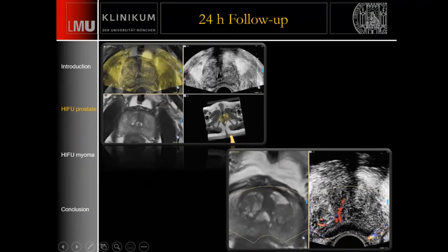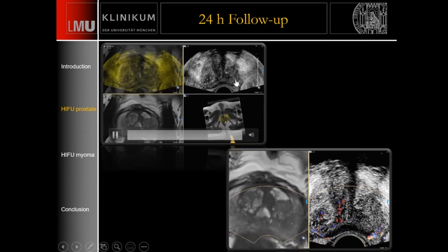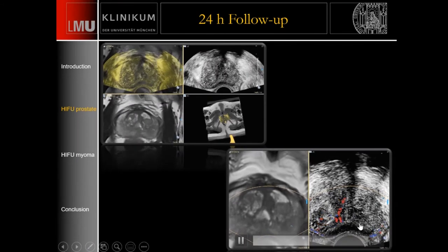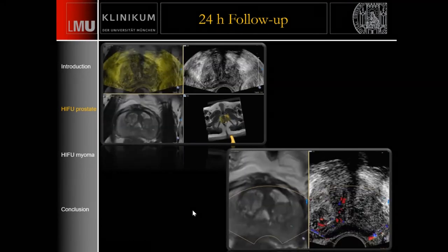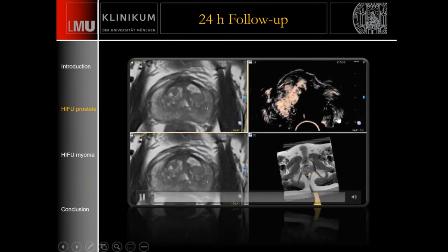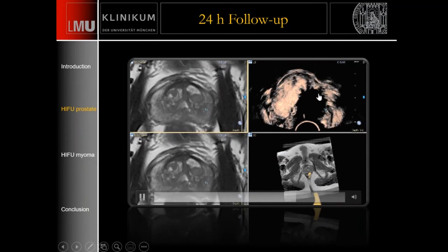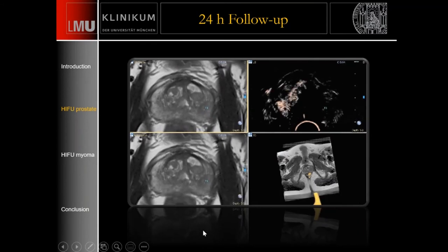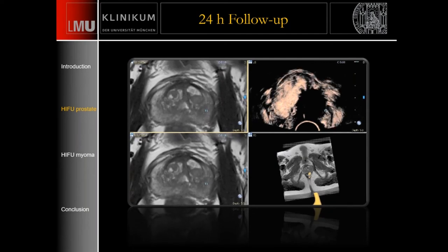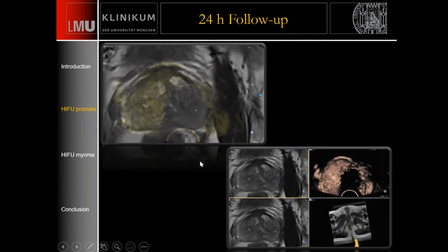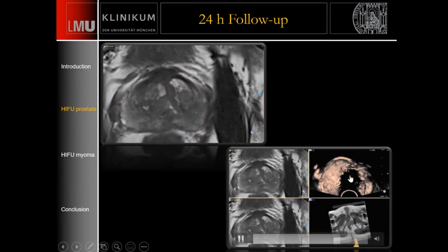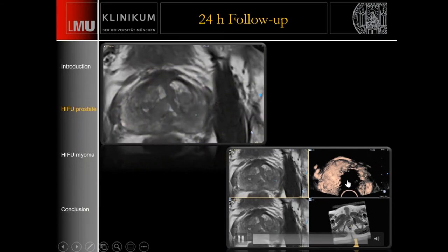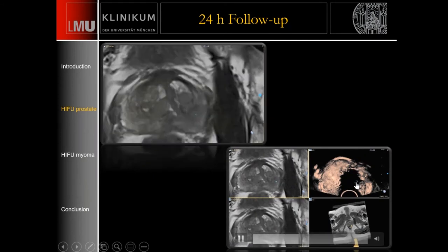At 24-hour follow-up, looking again at the lesion: the MRI shows a similar appearance with no vessels in the treated area — an indirect sign of successful treatment. Repeating the contrast examination shows nice perfusion of the right lobe and good necrosis of the left lobe, confirming successful treatment of the prostate cancer. The overlay matches well, and there is no contrast uptake in the treated part of the left lobe. There is some limited contrast uptake in the anterior part, but this has no influence on the cancer treatment.